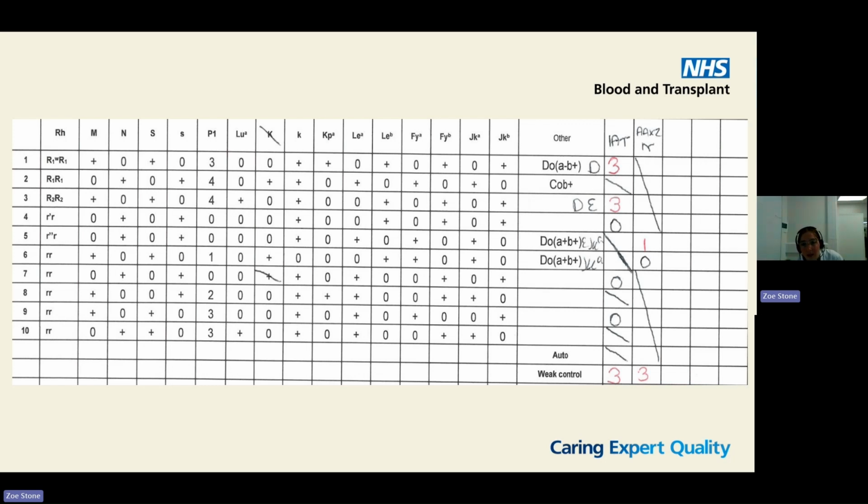We couldn't do our standard testing in RCI because they were weakly DAT positive and we use an IAT technique. But sickle patients are notorious for having the more unusual D variants that the genotype is the best way of detecting. So in this case, we didn't report the D type and we reported the D as not specified, because we couldn't call it either way. We had a D positive result with what looked like an allo anti-D.